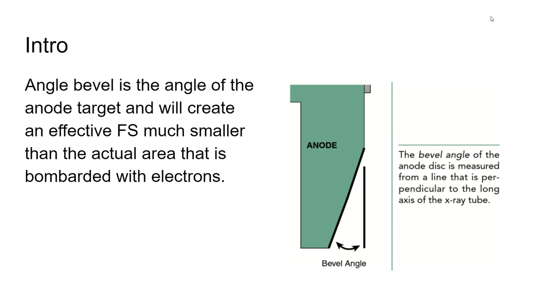As you should already know, I hope, there's an anode, part of the tube, and there's a part where the electrons will hit the anode. That is the actual focal spot, wherever it actually bombards the anode.